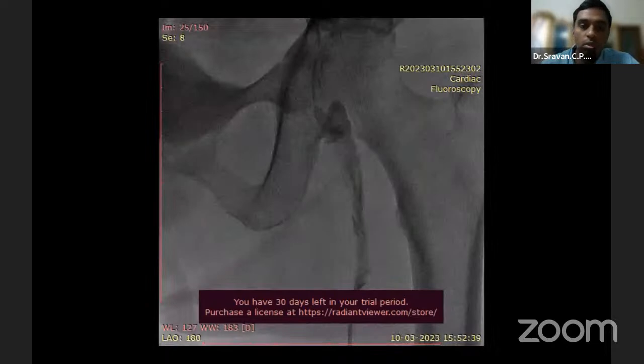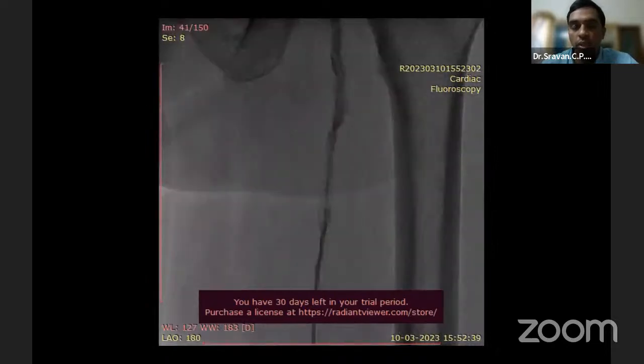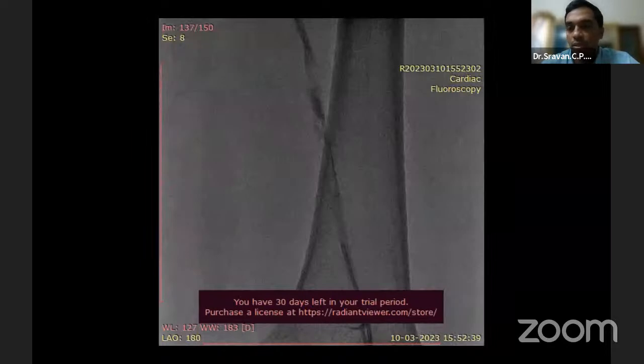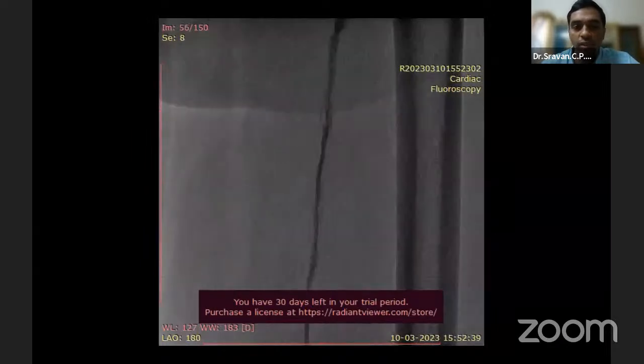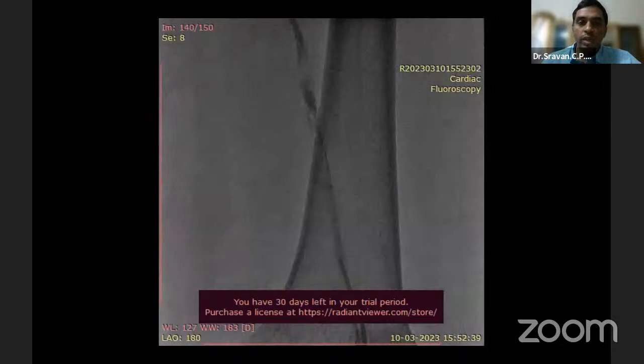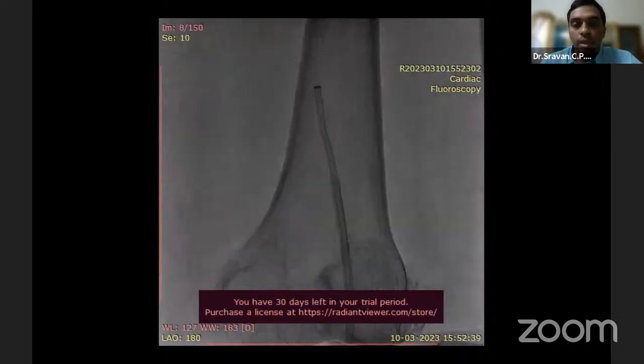But we did notice once it reaches the common femoral vein, the wire didn't go as easily as in the rest of the popliteal and superficial femoral vein. So correlating the Doppler and the CT and the in-cath findings, we decided that we were expecting some kind of chronic component in the common femoral vein region. So we decided to go with a Penumbra aspiration.